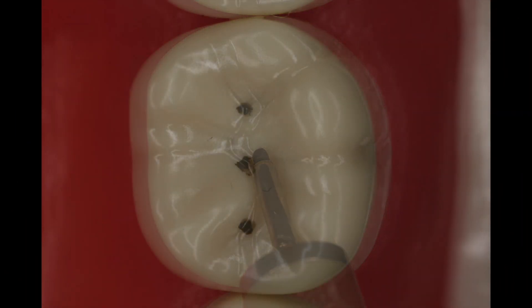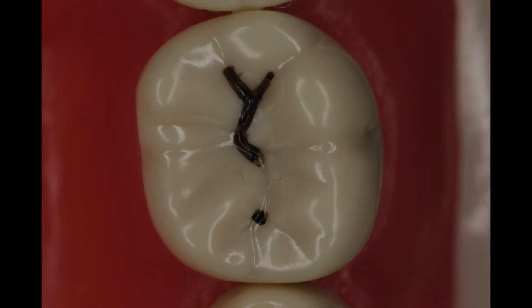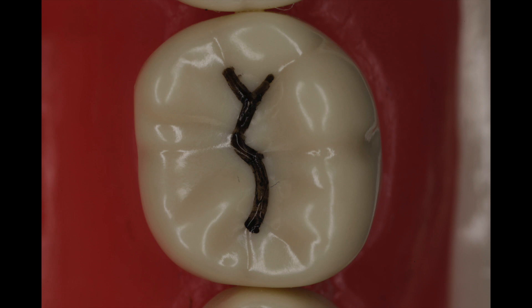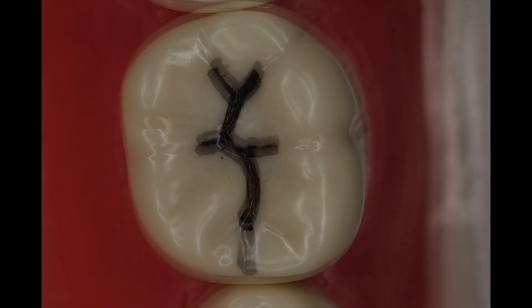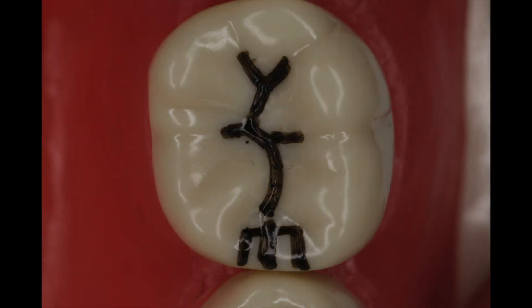We're going to identify the central pit, the mesial and the distal pits, then we're going to draw a line to connect those pits, remembering of course that the fifth cusp is actually a cusp that needs to be followed. After identifying these areas, we're going to extend to the proximal area right down the middle of the contact and give ourselves an idea of the outline form.